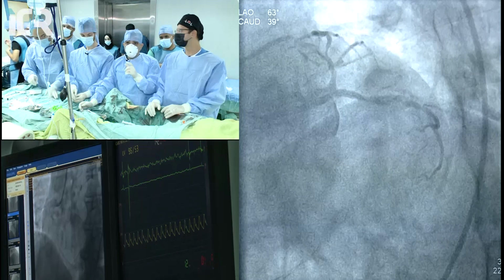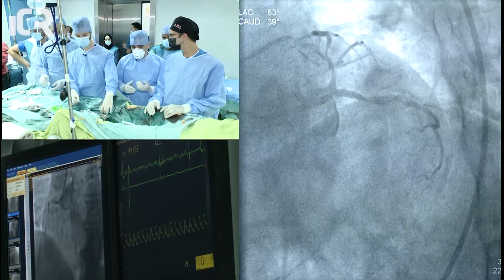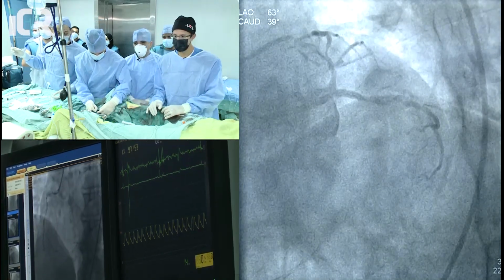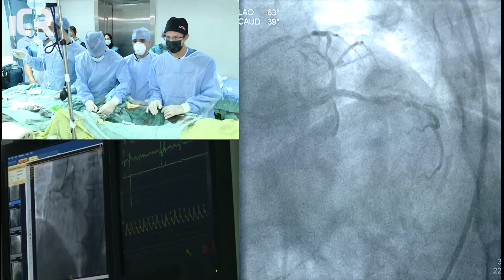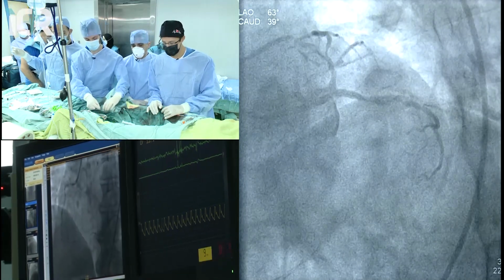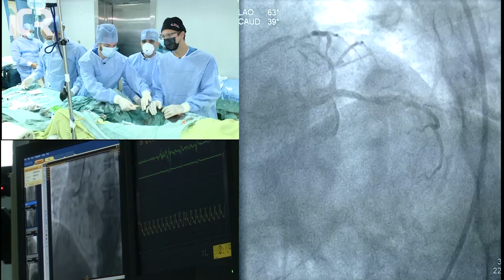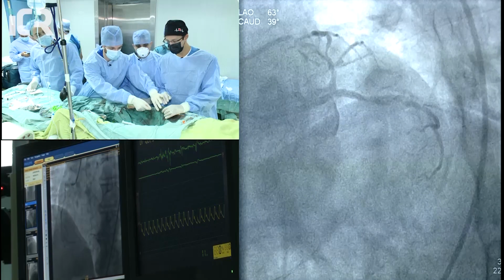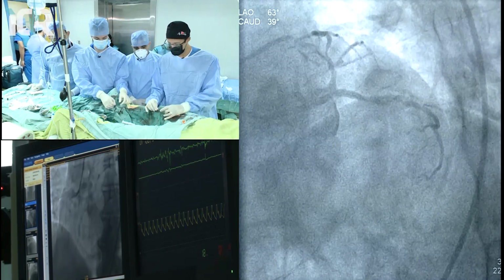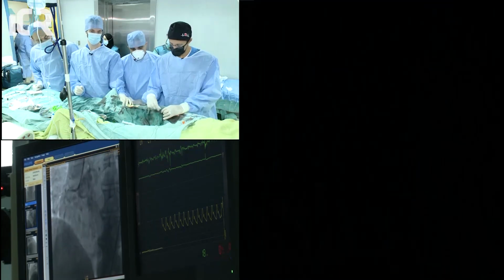Also, in my opinion, there is a severe calcification in the left circumflex, but we will try now with a 2 mm balloon. If we don't cross with this balloon, we have to start rotablation for both vessels, circumflex and left anterior descending. Actually, it's a very complex case with a double bifurcation, multi-vessel disease, and heavily calcified lesions. So we have a real complex case in all.